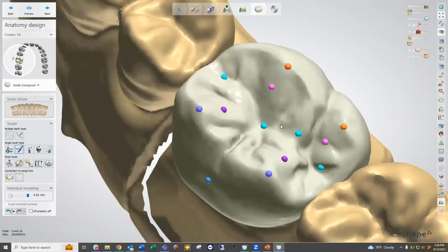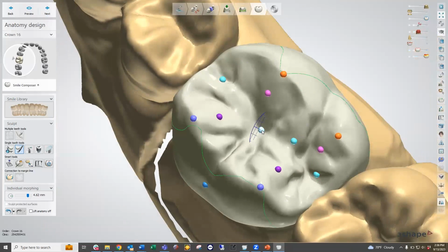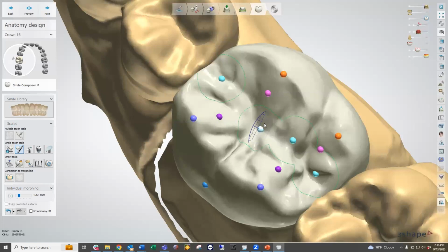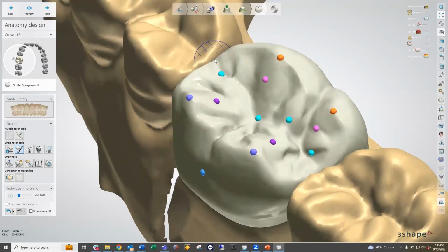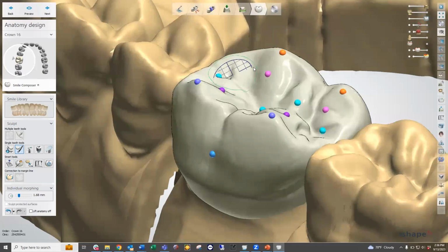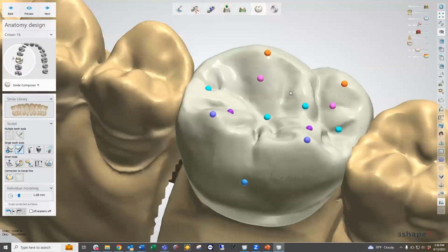Okay. Again, with all those dots that are the same color, we can make changes to those options just by clicking and dragging and holding the shift button to select all the dots of the same color at the same time. So at this point, I'm just going to be dragging certain areas up. Now, another cool function of this tool is the option to use the control key, which moves from this grid pattern to an arrow.